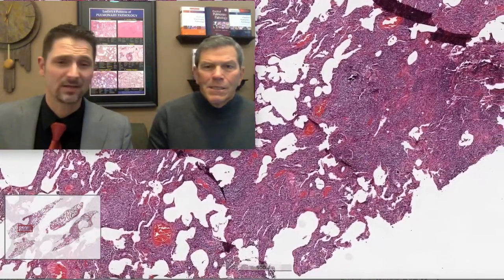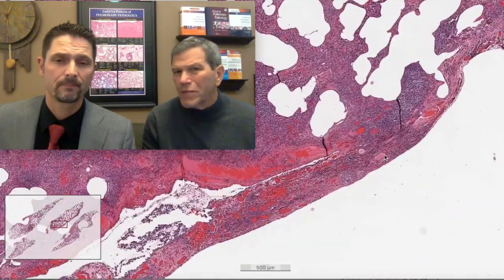Now, if you watched our previous video, you might be saying, well, this looks a lot like what you just described in GLILD. Interesting. Maybe this is GLILD. But we have no history. But it's got to be on the differential diagnosis at this point, right? Yeah, absolutely. Could be HP. You have to include GLILD. It's a little too cellular for HP.